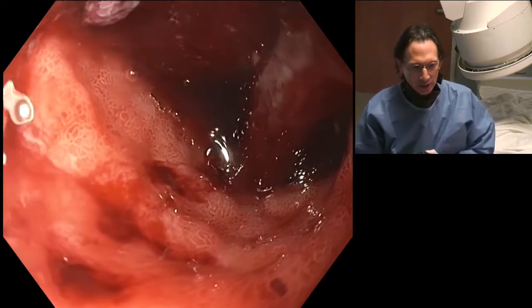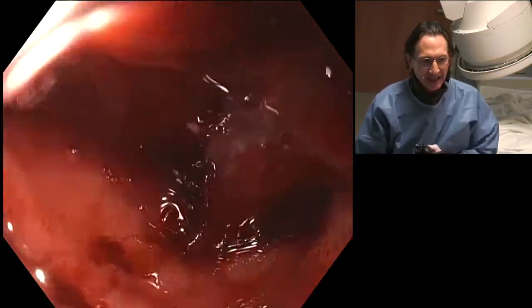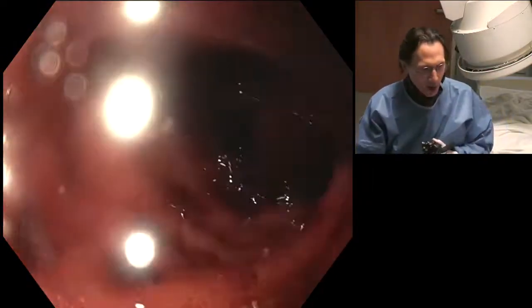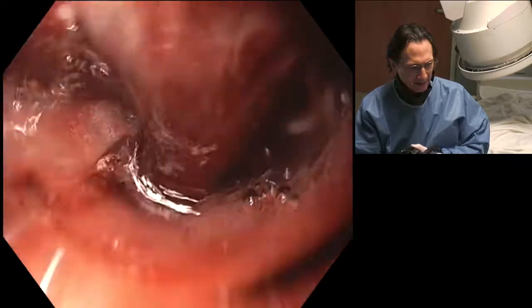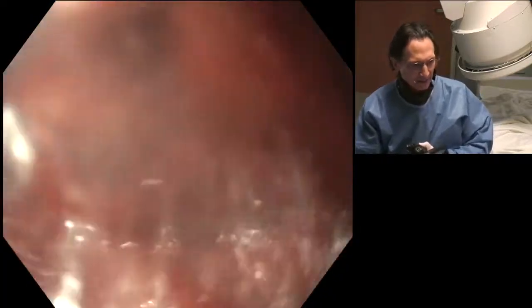And now you're looking endoscopically at the duodenum, and you can see it's just completely blocked here. I don't think there's any lumen to be found. I can irrigate a little bit with some water to see if we can flush out some of the... There is a little bit of blood clot here as well, but I think most of this is tumor ingrowth of the duodenum.